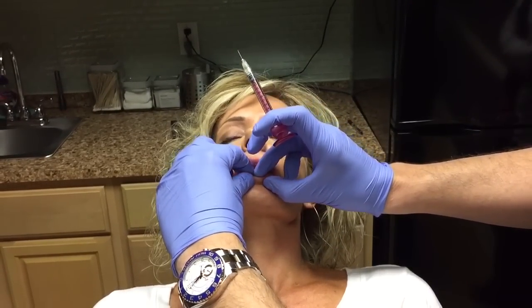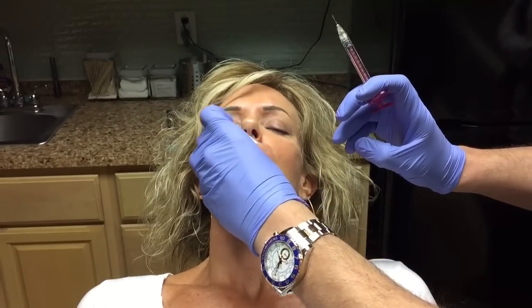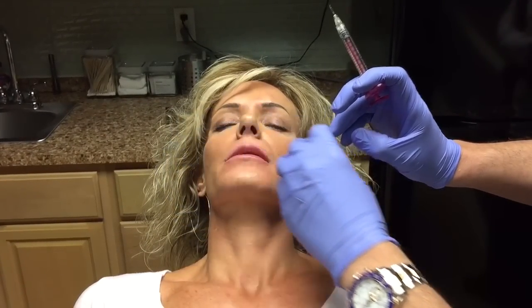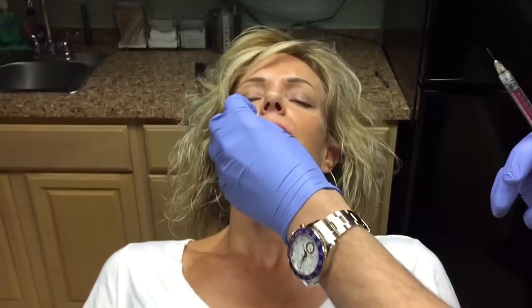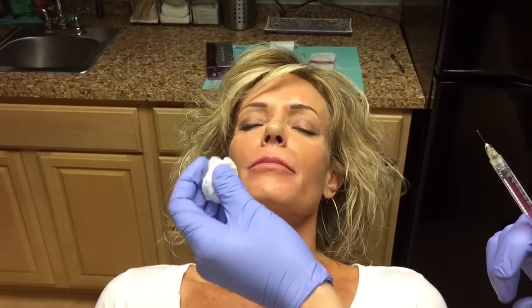I don't do a whole lot of massaging. When you place it in the right place, you don't have to massage the heck out of it. You just rub it once or twice and it's done. Now, I check for symmetry. I want you to smile for me. Big, big smile. Good. And I want you to blow a whistle. Good. Perfect. Nobody's lips are perfectly symmetric, but you check for symmetry this way.